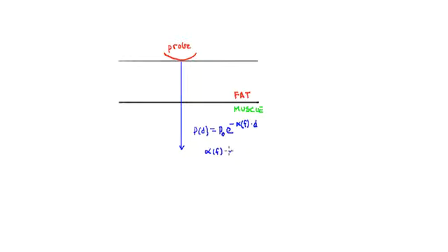And alpha of f is approximately proportional to frequency. So it goes up as frequency goes up linearly. That means that at higher frequency, alpha f is bigger, and there's more attenuation of the ultrasound beam. So that's a key concept in ultrasound. Higher frequency, more attenuation. Or alternatively, lower frequency, you can go deeper. Now strictly, this only really applies in the far field limit, so kind of far away from the face of the probe, but it's a good concept to have.